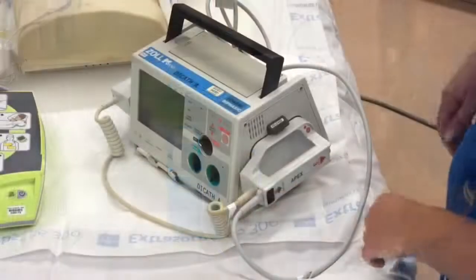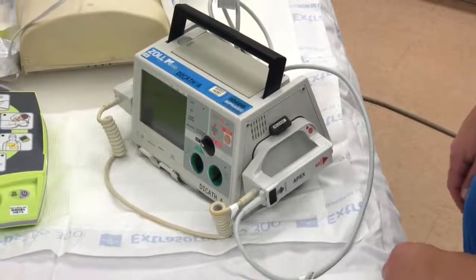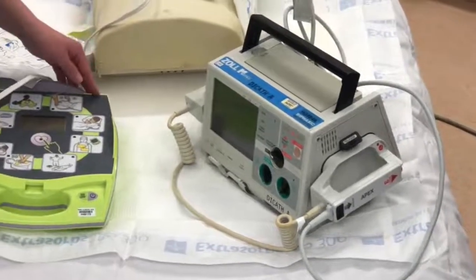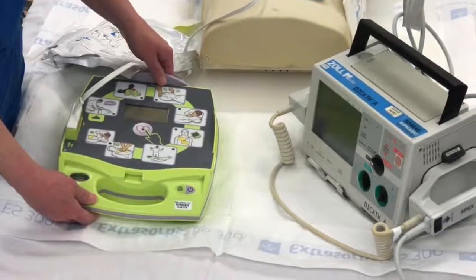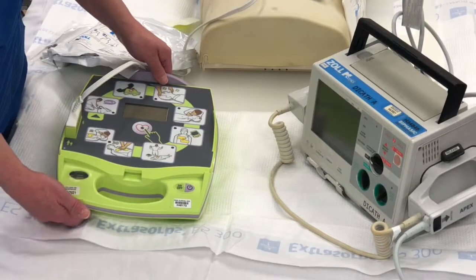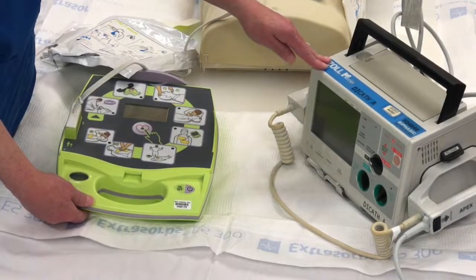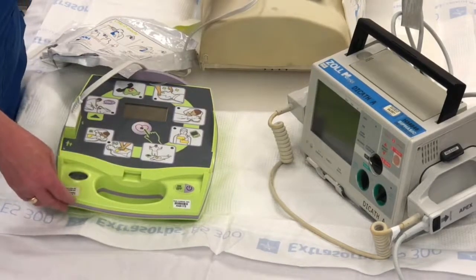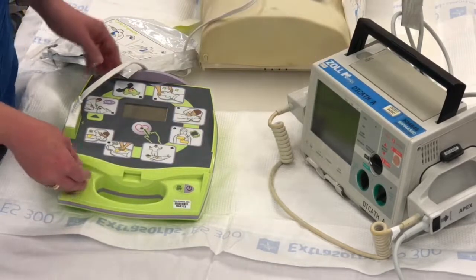Now we'd like to teach you how to transition a patient from the Zoll AED Plus to the Zoll M-Series manual defibrillator. The AED is going to tell us if the rhythm is shockable or not shockable, but when our adult medical emergency team arrives, they will want to use a manual defibrillator so that we can read the rhythm. We can stay using the AED pad and transition the patient to the Zoll M-Series.